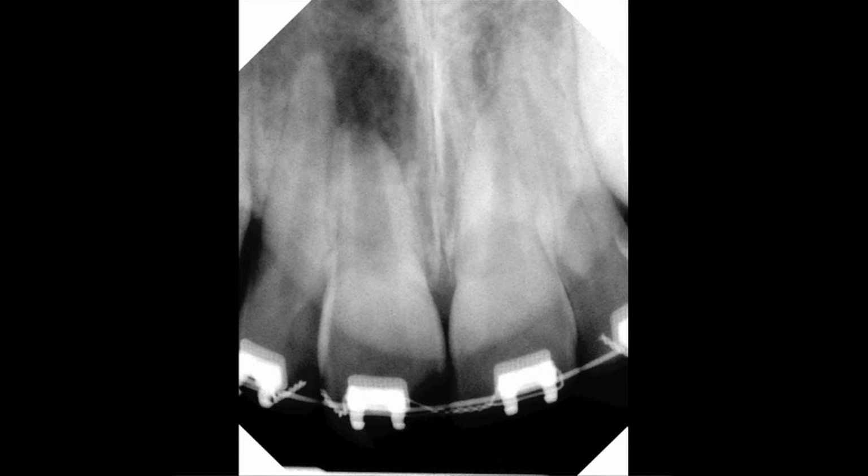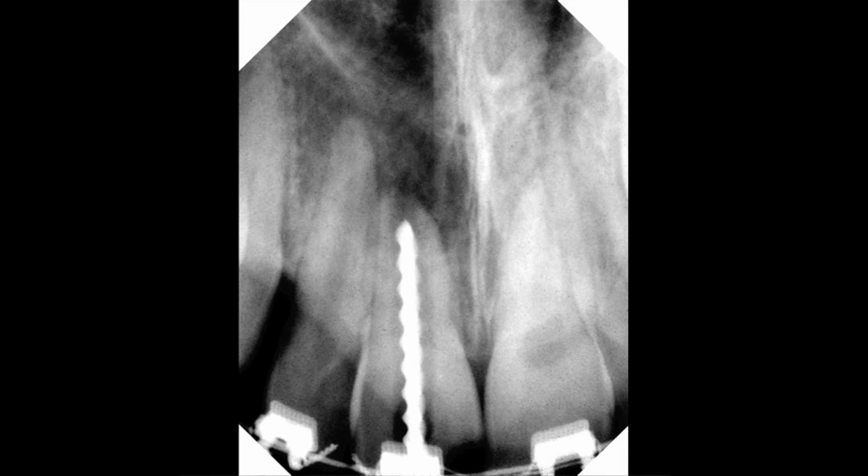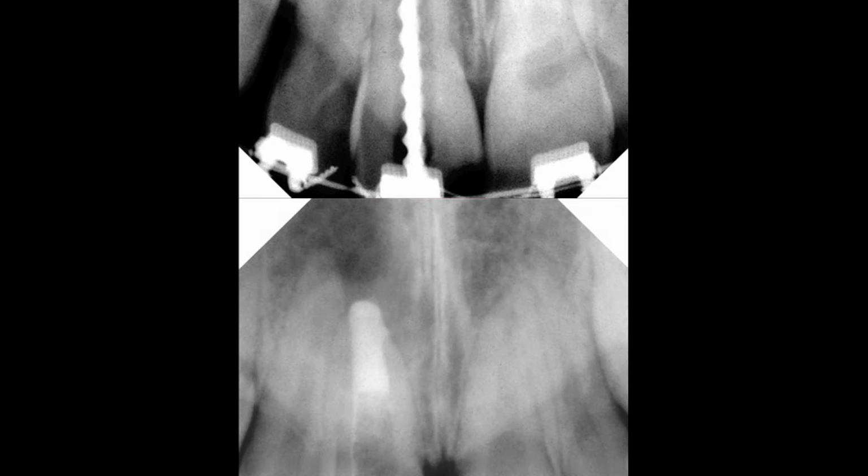This case is of a maxillary central incisor with a necrotic pulp and a large apical lesion. The patient also is undergoing orthodontic treatment. In order to establish length in a tooth with an open apex, you must utilize a radiographic method by inserting a file and taking a radiograph, because the apex locator will not work in a tooth with an open apex.